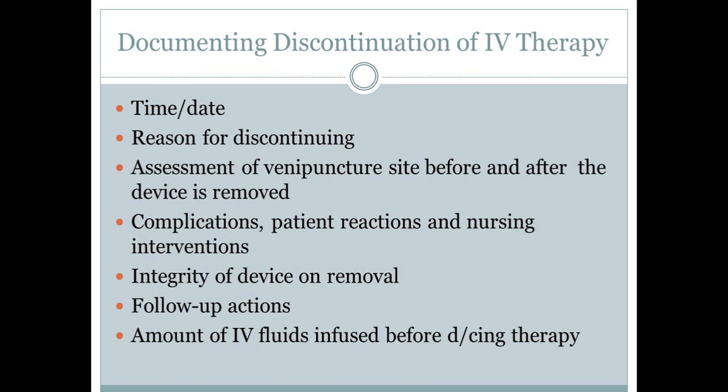So anything I do, I'm going to document if there's anything out of the ordinary, depending what you document. If you document by exception, follow your facility policy. Your facility policy also might have something in place that if the IV insertion site is showing signs of infection, such as maybe redness, it feels warm, or if you have some yellow drainage, things are out of the ordinary.